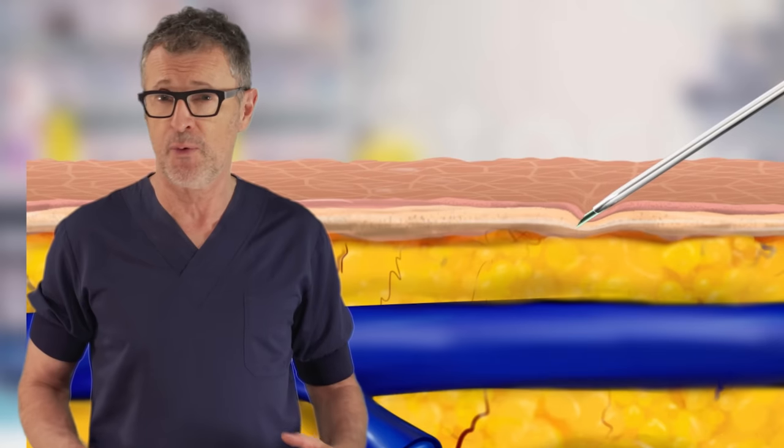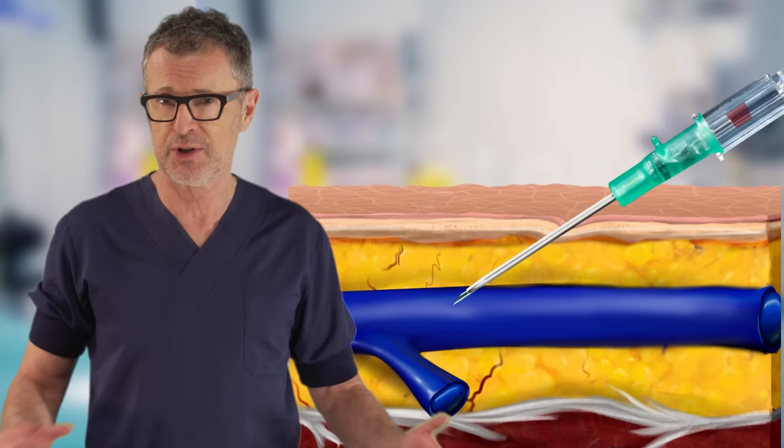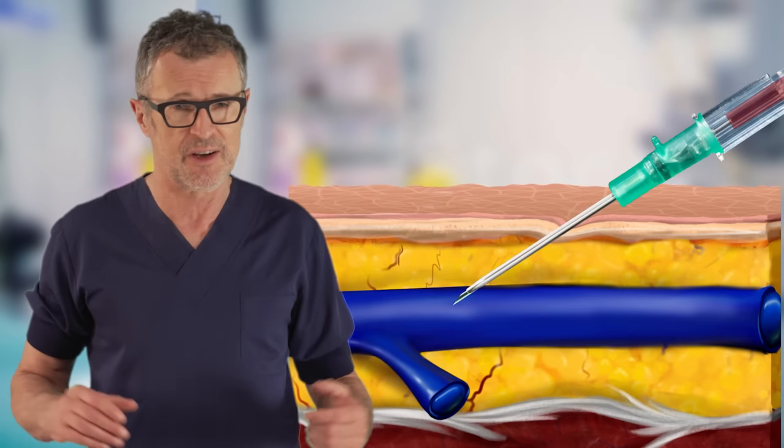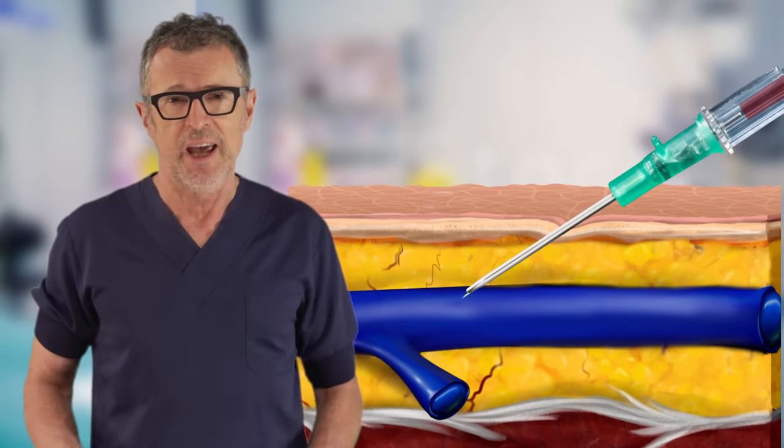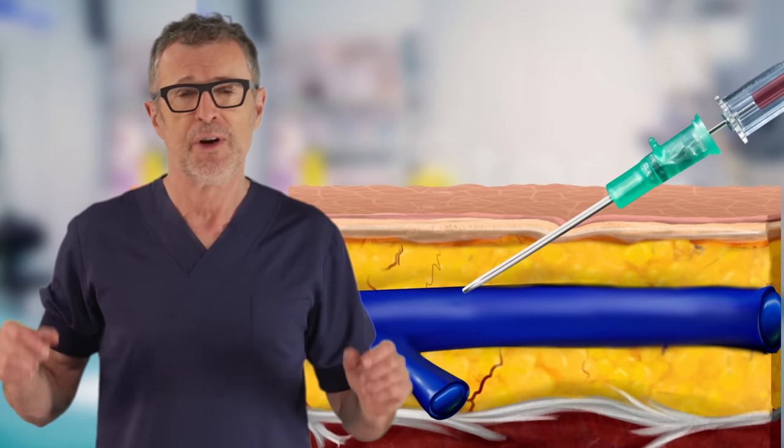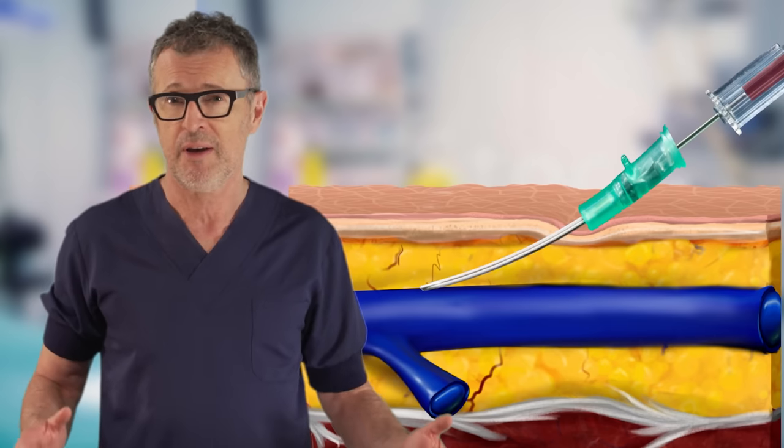Greetings and welcome back to NYSORA's YouTube channel. As a practicing anesthesiologist, I have performed countless IV cannulations and I have taught students, nurses, younger colleagues, anesthesiologists, you name it. And in this video, we're going to feature what I think are the three most common reasons why IV fail.